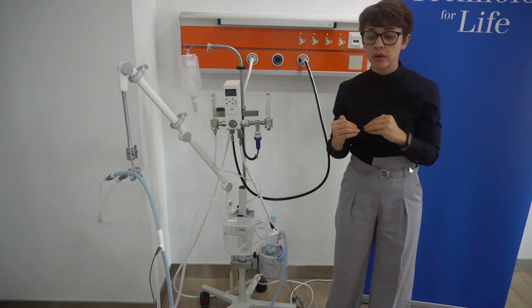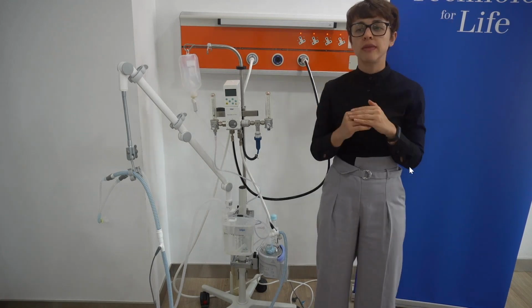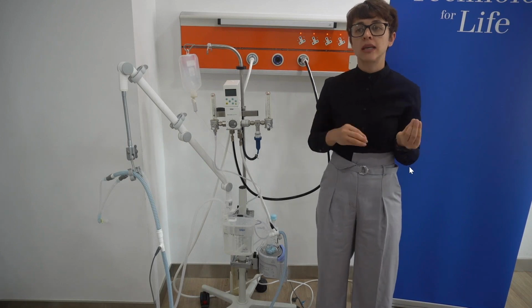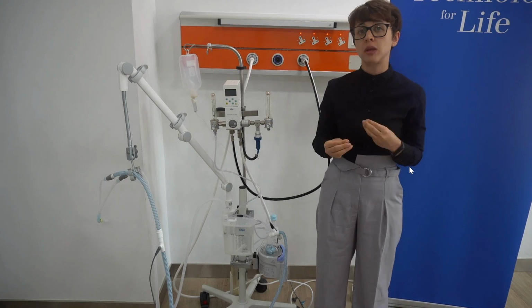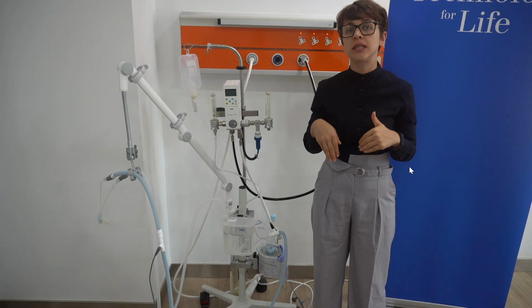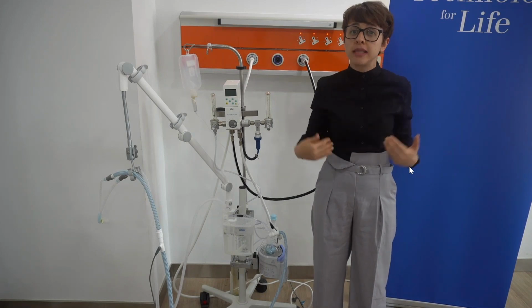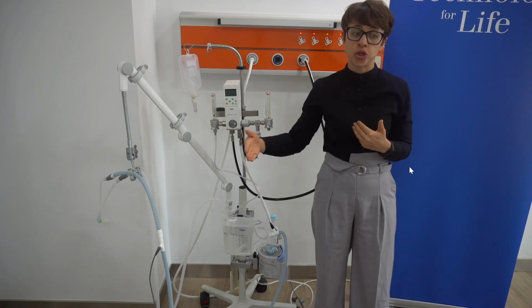So in general, during CPAP therapy, you can say that CPAP is the same as PEEP, but from the physiological perspective, there might be differences because of the intrinsic PEEP, the positive end-expiratory pressure that is building up in the lung because of the challenges with expiration.